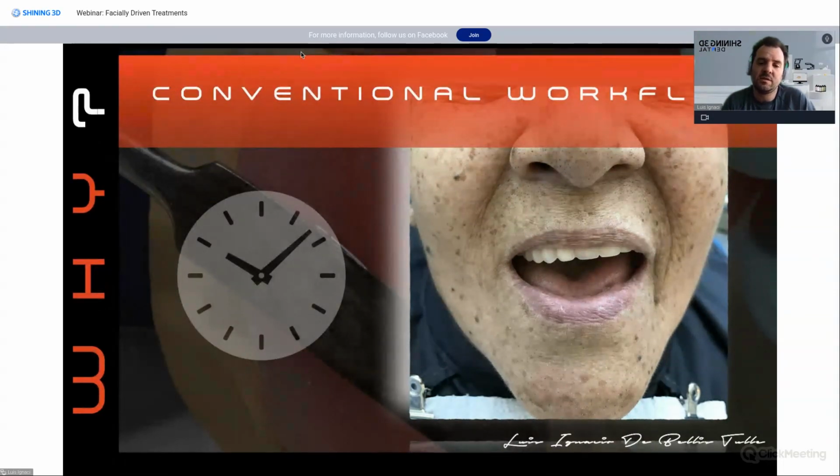And when we are working with our bite block, we will try to put the midline of those teeth in the best position, but maybe I was standing on the right side of the patient, and due to problems of perspective, I'm putting that midline not perfectly centered.